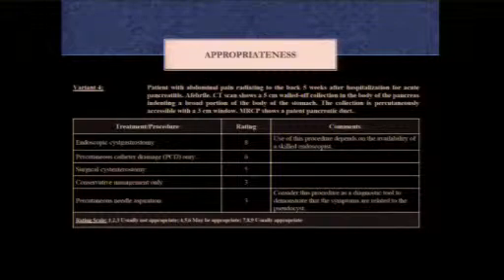So case 4 talks about peripancreatic collection, and they've designed a number of criteria based on the Atlanta classification for pancreatic collection. So you can either have a peripancreatic fluid collection that over the course of 4 weeks matures to become a pseudocyst.